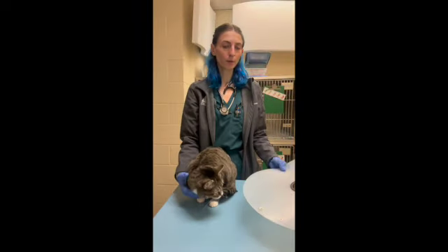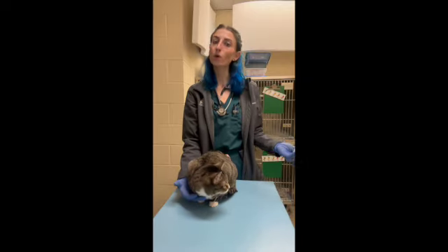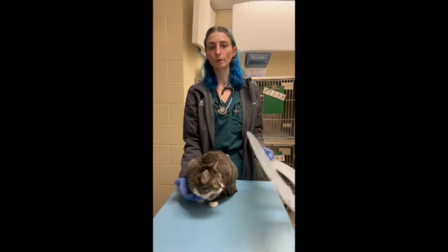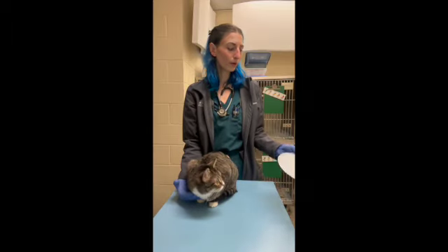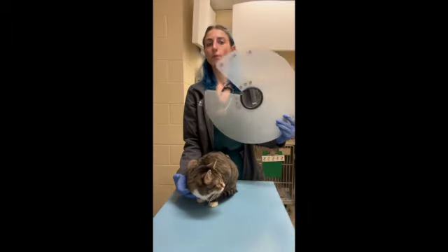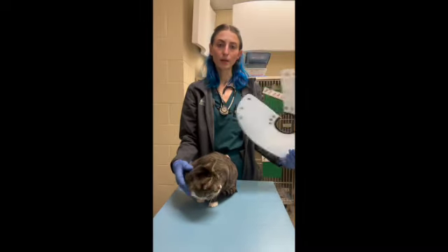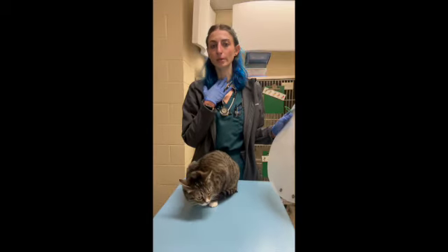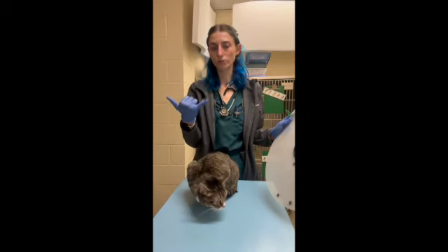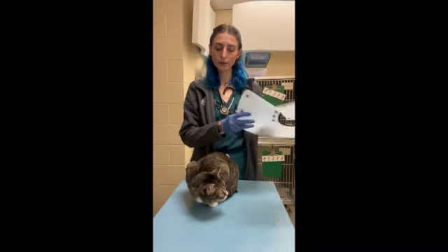Typically we go by size variation, and also depending on whether the patient will be going home with this e-collar or if it's just going to be used for patient care and technician support in the hospital. These are the ones we typically keep in hospital for unruly cats. You want to make sure it's an appropriate size to fit around your patient's neck, not too snug but also not too loose. So I think this will fit her neck appropriately.